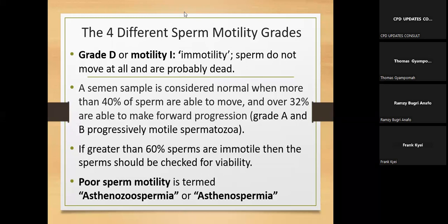So we need to be able to also adjust our references. And before you adjust your references, you must conform to what they say you should do. Because you can't do something a certain way and then go and use that reference range. That could be problematic. Good.